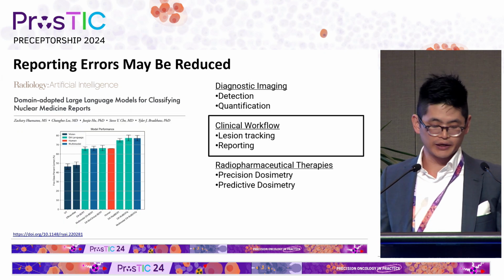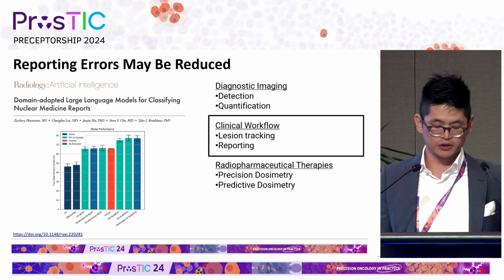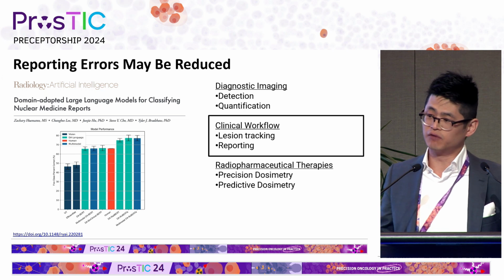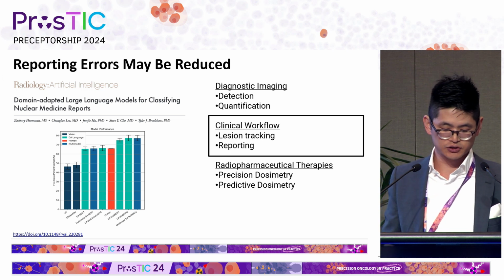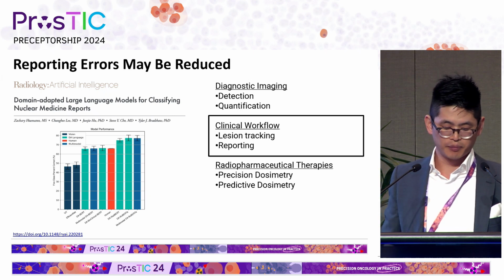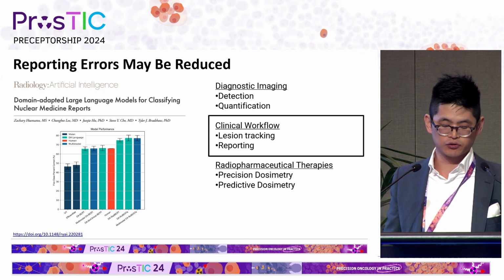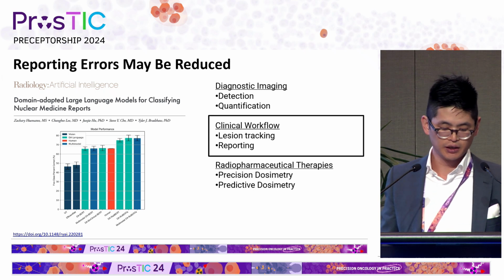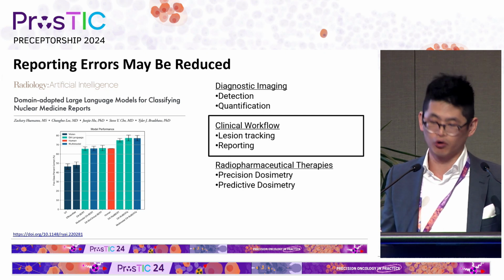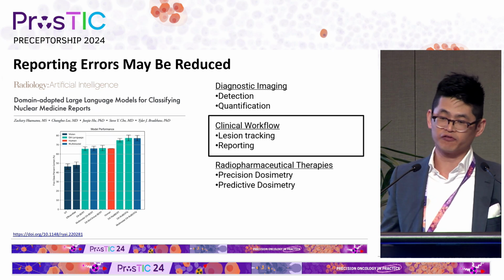Interestingly, large language models have also been used to look at the content of the report to classify the patient outcome. And this is an example. It's in lymphoma, not in prostate cancer, and focuses on the lymphoma Deauville score classification. But what we can see is probably there'll be similar applications in prostate cancer to look for report discrepancies. And this example is interesting because it also introduces the idea about multimodal models, ones that can use both vision and language that are actually more effective in this task.